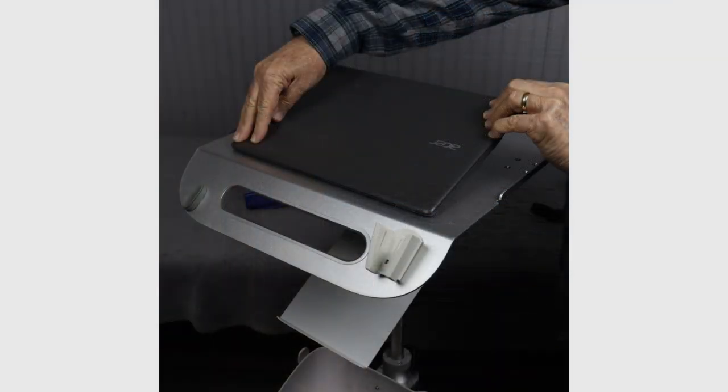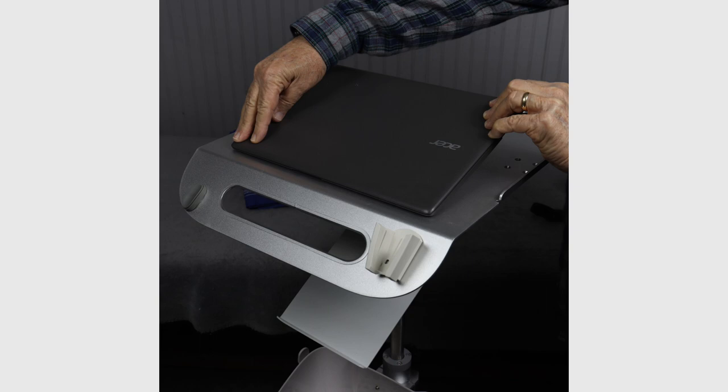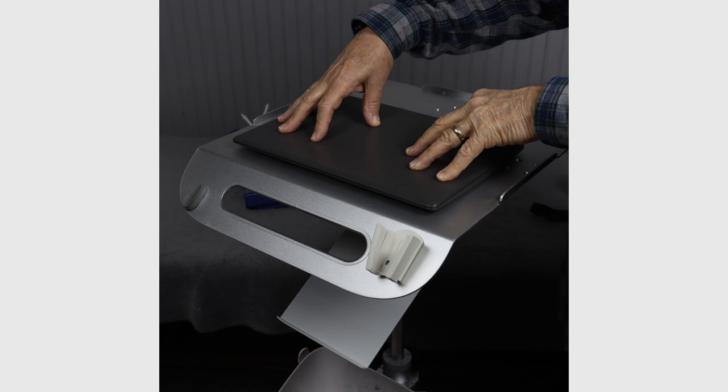Center the computer on the tray as shown, placing the front Velcro tabs into position first and then the rear. Once in position, apply 20 seconds of moderate pressure to ensure adherence to the tray.